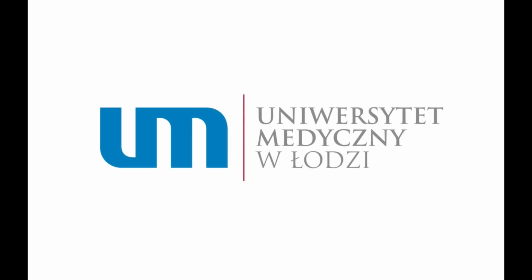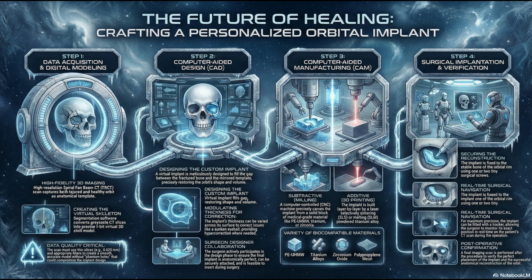Welcome to the debate. Today we're diving into a really fascinating topic, the rigorous protocol for creating individualized orbital reconstructions using CAD/CAM technologies. This is something that has completely changed how we approach complex craniofacial trauma, especially when the orbit is involved and you're dealing with issues like double vision or major volume problems.